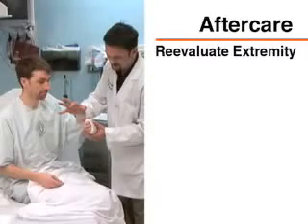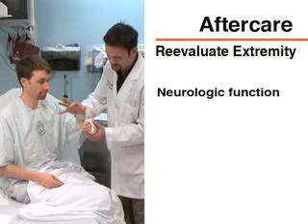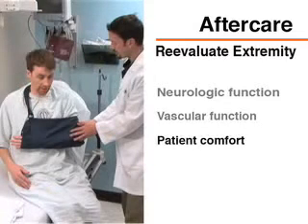Re-evaluate the extremity immediately after completing the splint placement. Evaluate distal motor and sensory function. Palpate for pulses, evaluate the color of the extremity, and assess for appropriate capillary refill. Be sure that the completed splint is comfortable and not overly restrictive, and that the patient's pain is controlled. Address any discomfort by applying additional cotton padding or loosening the elastic bandage.